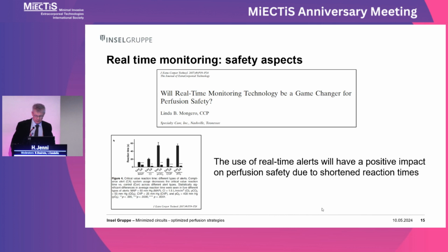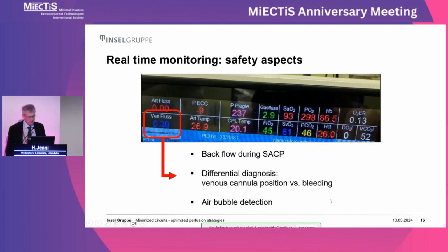That really helps. Also, when we started with automatic data registration, I felt a bit lost, because I couldn't make notes about the blood pressure, for example. And then sometimes if the blood pressure decreased, I didn't realize it. That's why I speak from my side, you know, I know that. So it's really important to put alerts in. And then that will also be published from my angle. Just to give you an idea about monitoring.